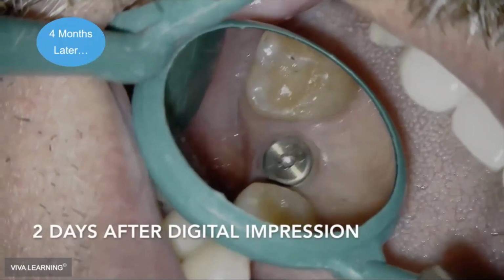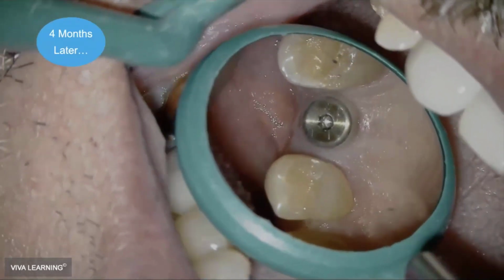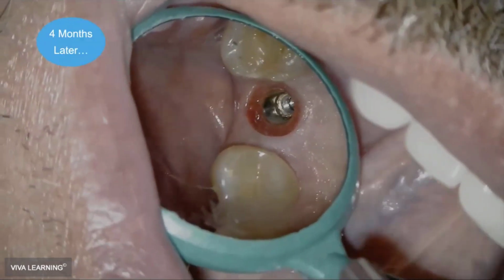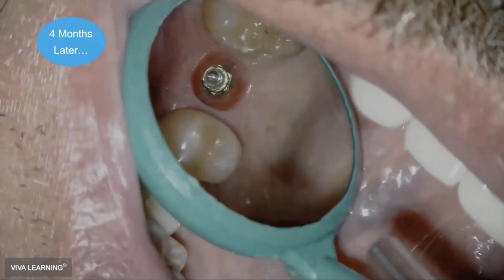So there we are, 2 days later. The tissue is nice and firm against that composite that we made. And then that's going to allow us to seat a crown with minimal blanching.